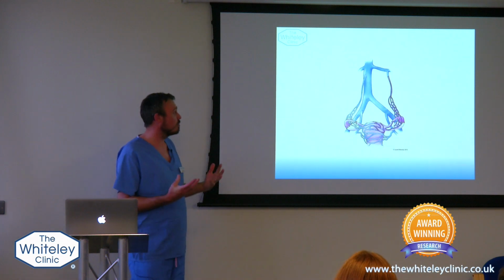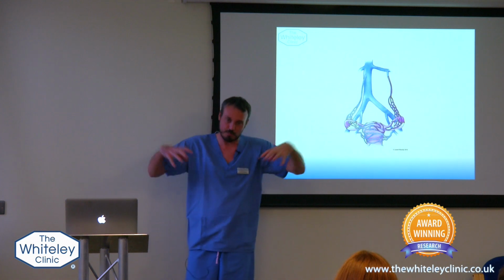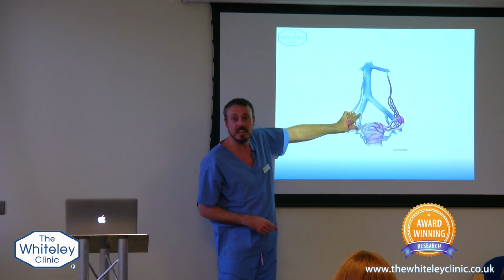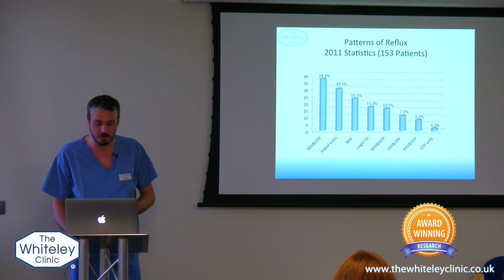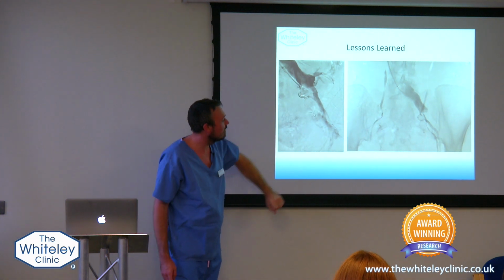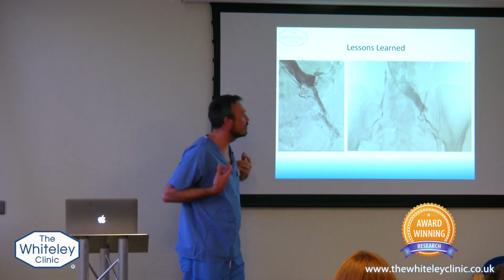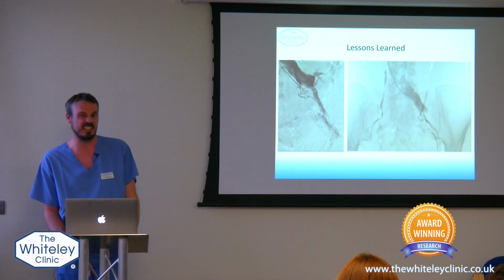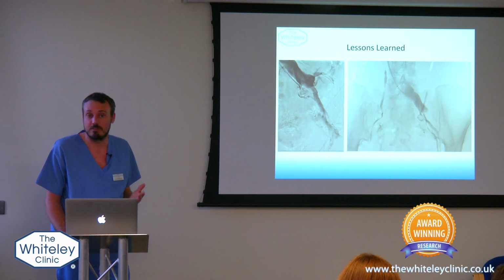So at first we thought, well, how can we take off that pressure, that reflux back down into the pelvis? Well, surely if we just take out this vein here, that's good enough. So when I was first starting, we thought, yeah, put in a big coil in that position here, one on that side, one on that side, and just stop the reflux into the internal iliac veins, and that will solve the problem. But it didn't at all. And actually, the patients got no benefit from that at all.